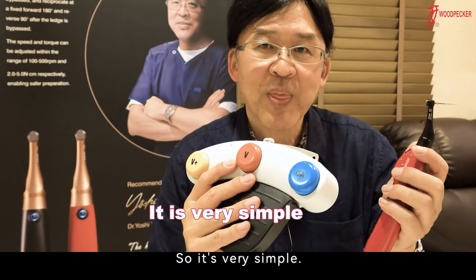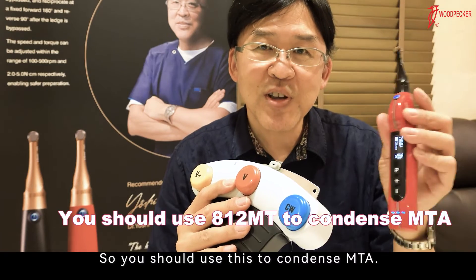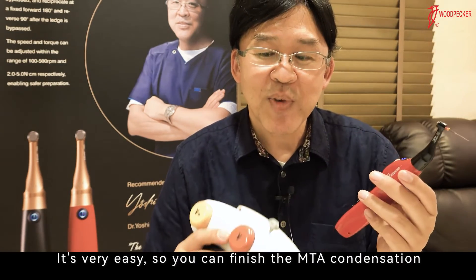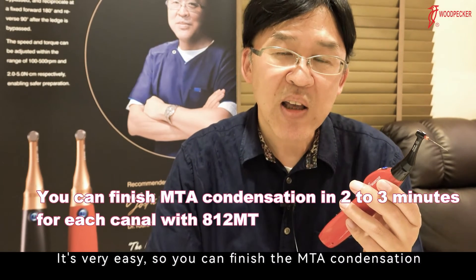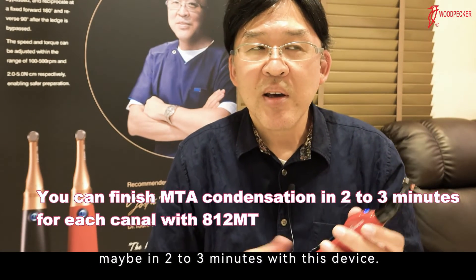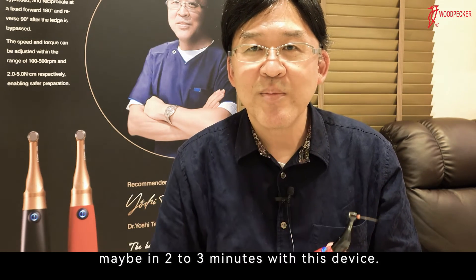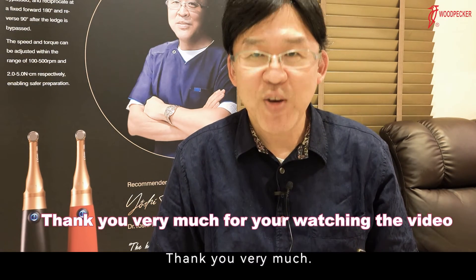So, it's very simple. You should use this to condense MTA — it's very easy. You can finish the MTA condensation in maybe two to three minutes with this device. Thank you very much.